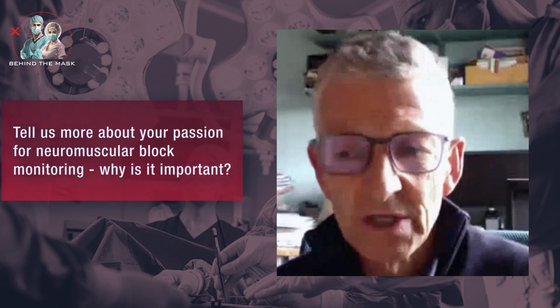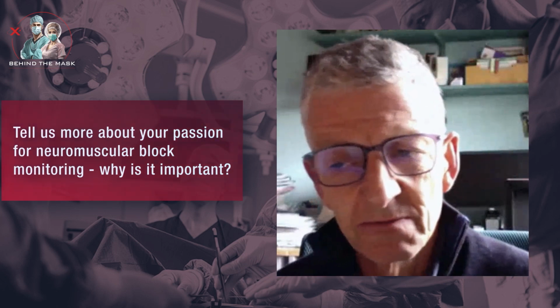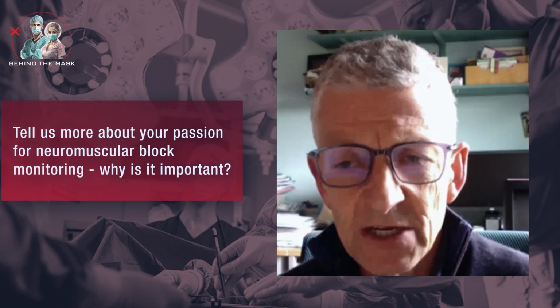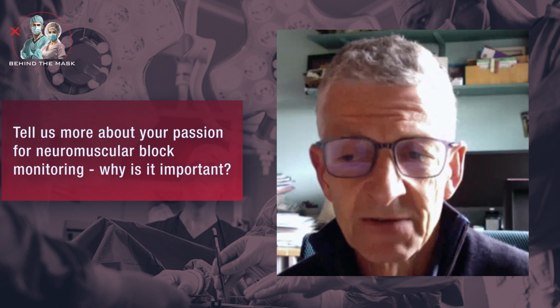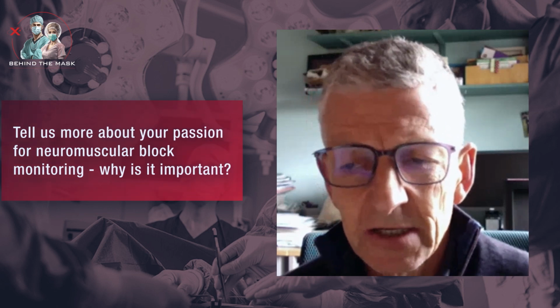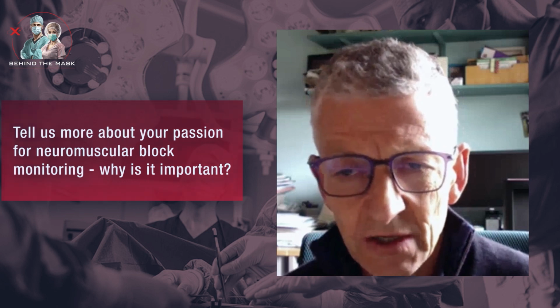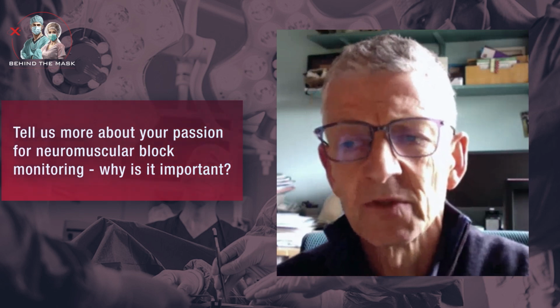The most recent update has moved on further and quite clearly stated, amongst the key recommendations with some backup evidence and key publications, that there should always be quantitative neuromuscular monitoring throughout all phases of anesthesia.